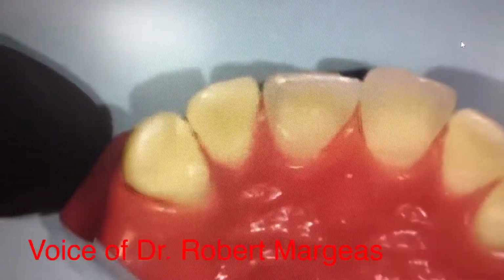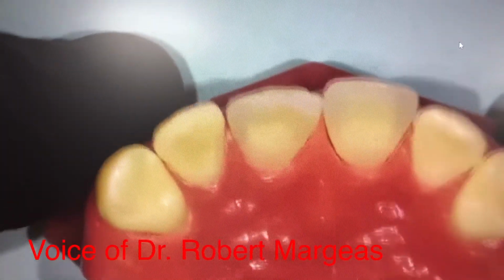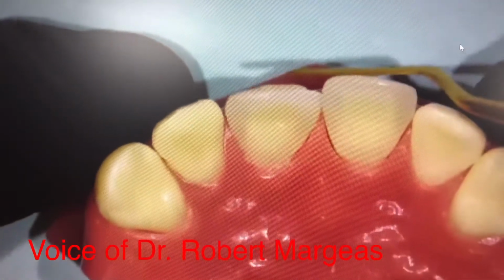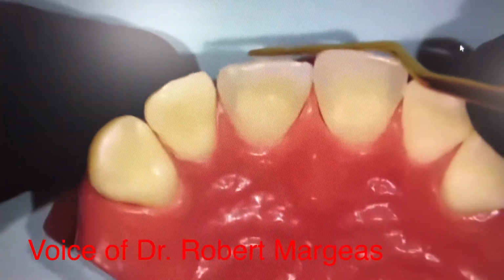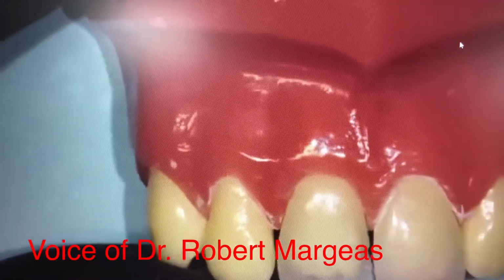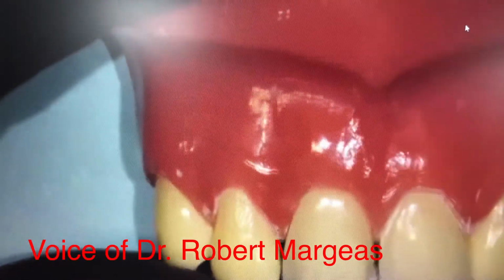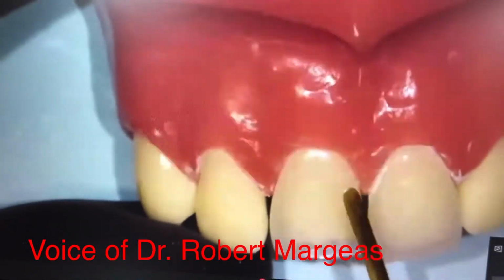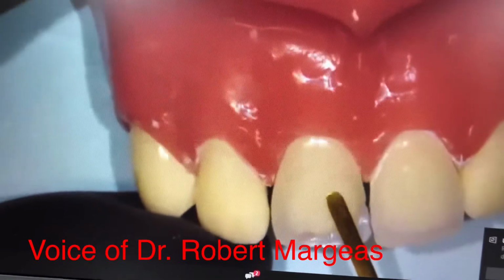So if I'm looking from the incisal, look at this here. I still have room for my enamel. I don't want this to be too far out so that I don't have room for my enamel. You can see I have room there. So you can start to see that this blends into the tooth. You don't see where the fracture line was.